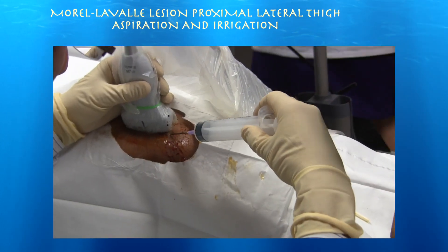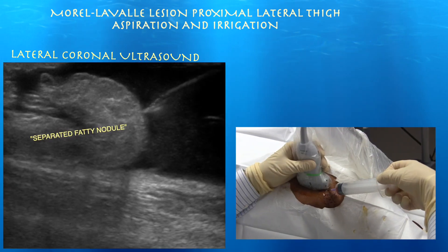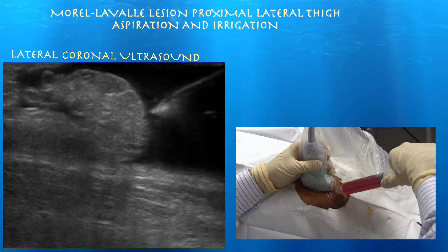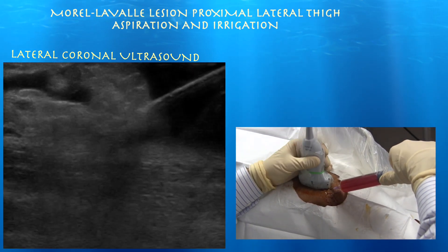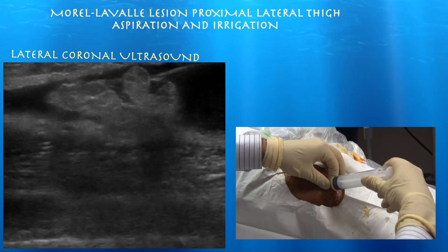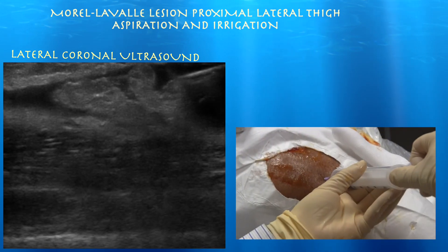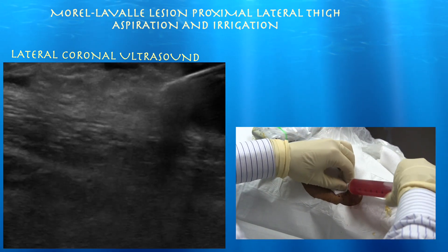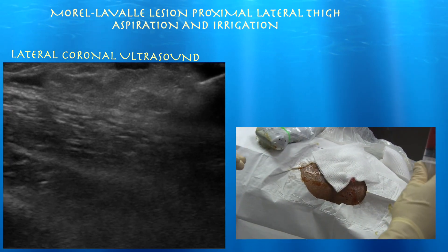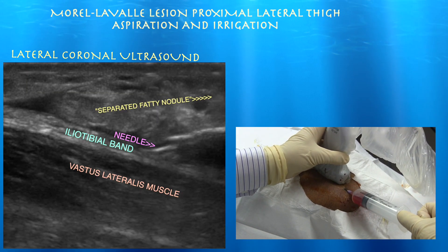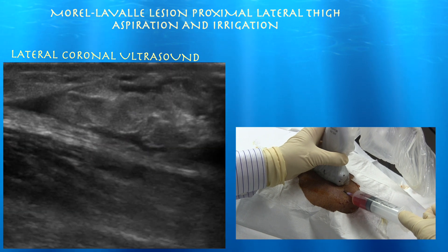Here we are trying to drain it — this is our first attempt. Even though it's easy to drain, you could get your needle stuck in one of these fatty nodules and finish the procedure prematurely. We've gotten quite a lot of fluid out. You always want to keep your needle tip within the black zone, within the fluid. Ultrasound helps you avoid irritating the iliotibial band by keeping the needle just superficial to it.